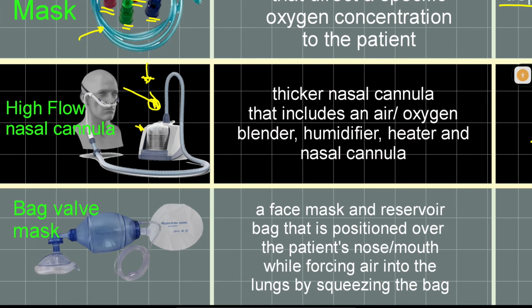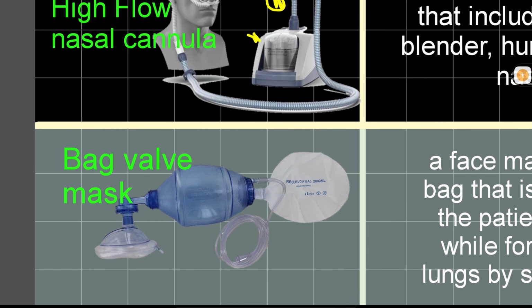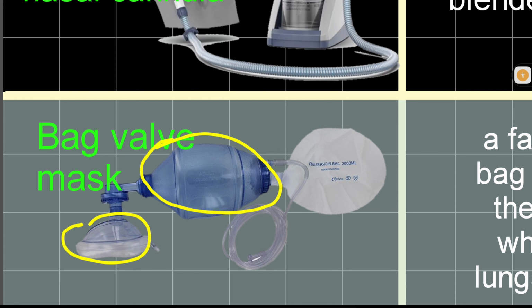We now move to the last device for today's video and today's list. The last resort that you can use before you intubate the patient is the bag valve mask. If you haven't seen a bag valve mask, this is how it looks. It has a mask here, a valve, a big bag, and a reservoir, together with a tube that is attached to your humidifier.